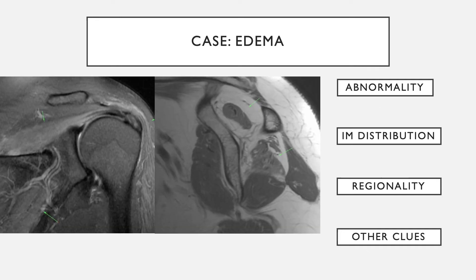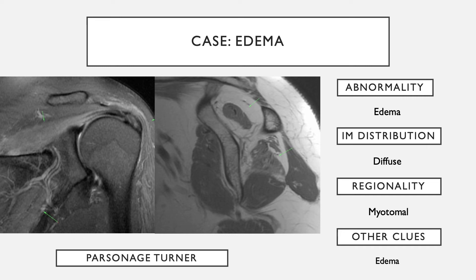Moving to the next case, there is diffuse muscle edema involving both the supra- and infraspinatus — two muscles supplied by the same nerve. There is no discrete lesion along the nerve in the distal portion, so you have diffuse edema in a myotomal distribution without a focal lesion. This would make one think of a neuropathy causing this, such as Parsonage-Turner syndrome — where more proximal nerve involvement or neuritis of the suprascapular nerve is the cause rather than a discrete lesion.